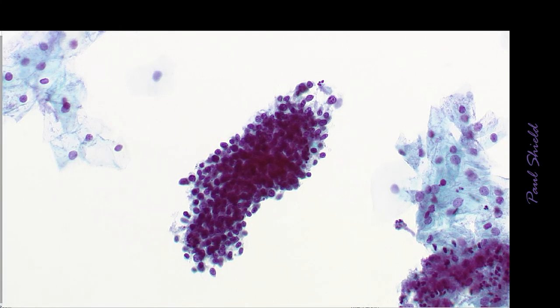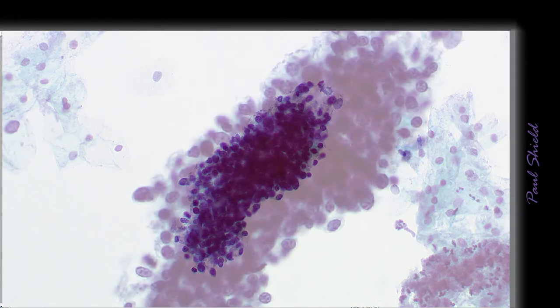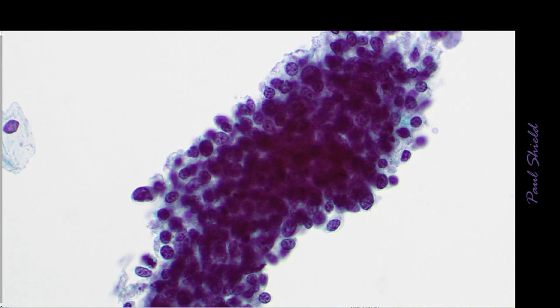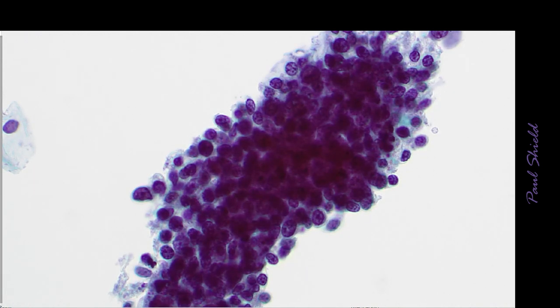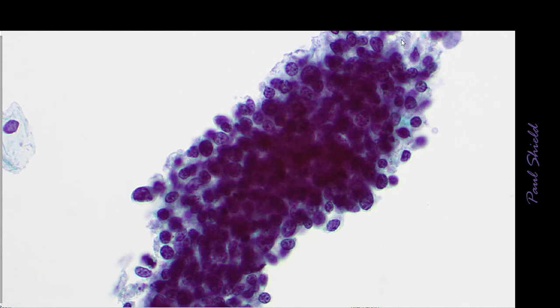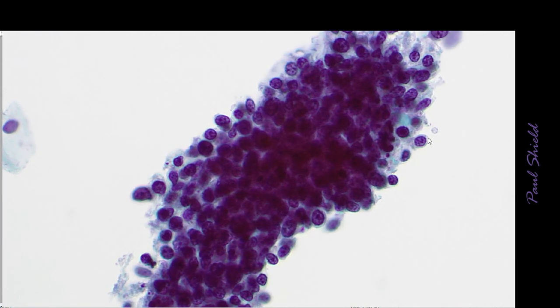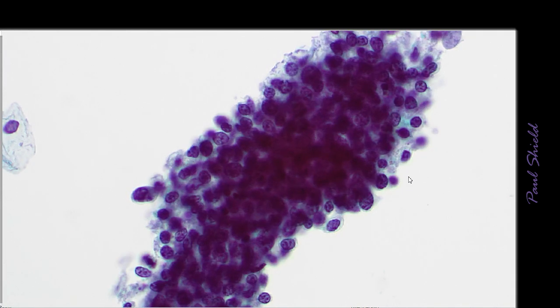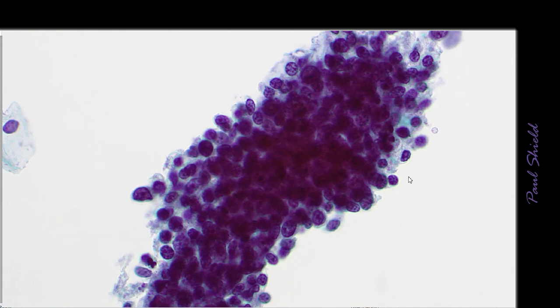Another area that's very tricky and a lot less common is follicular cervicitis. So when you get artifactually clumped groups of lymphocytes, this is an example of that, and this looks really like a crowded hyperchromatic group with high NC ratio, so it's quite tricky. What you have to recognise here is the very small size, hard to compare here, I don't have an intermediate, and the very round shape to all of the nuclei.